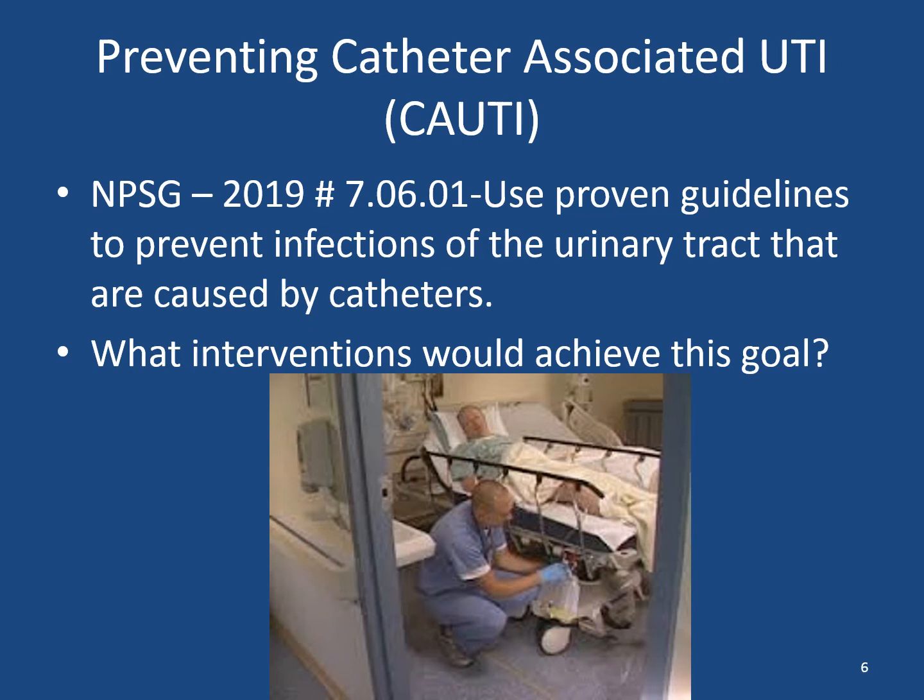We avoid irrigation when possible, unless the catheter is obstructed. Disconnecting the catheter from the tubing, because again, the more we do that, the increased risk there is. We want to avoid replacing it routinely. We want to make sure that we're cleaning the periurethral area whenever possible. A lot of facilities will have it that we are cleaning the peri area every shift and as needed. So if a client has a bowel movement and they're incontinent and then there is stool around that catheter, we want to make sure we're providing really great catheter care.